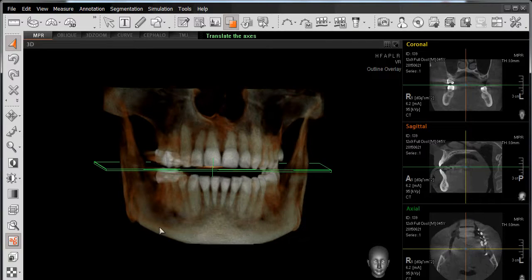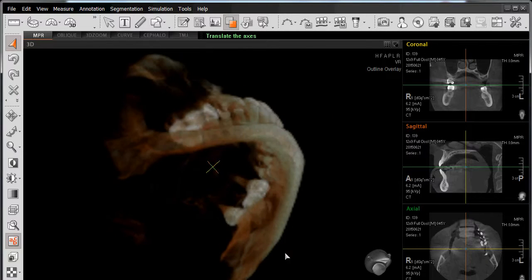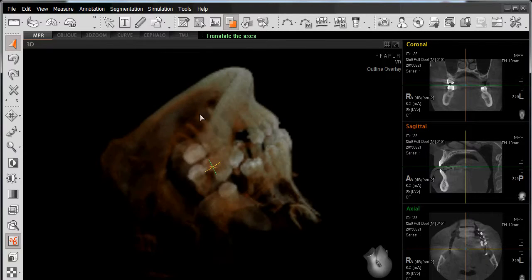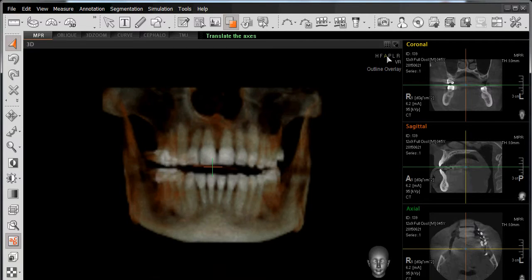And at any point in time, if you've rotated the anatomy to a point where you're having difficulty making heads and tails of your view, simply position the mouse on top of these snap views, left-click, and bring the image back to its original orientation.